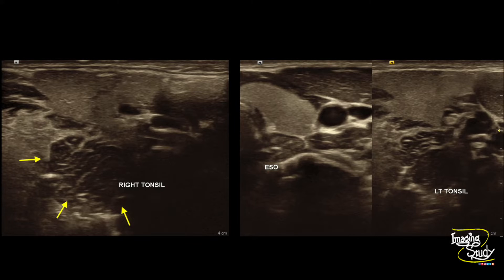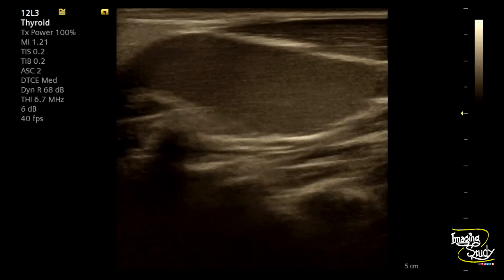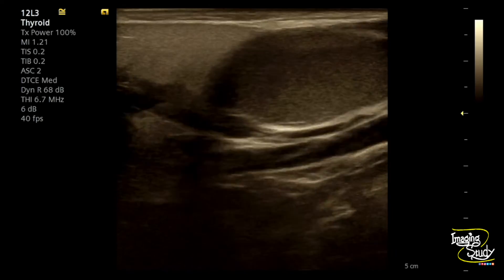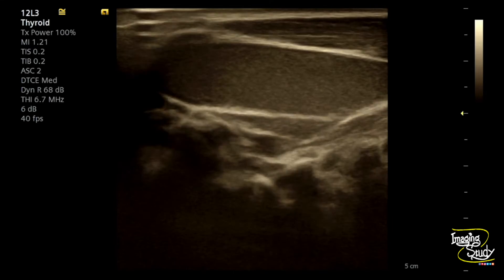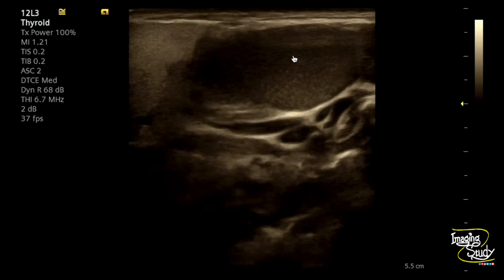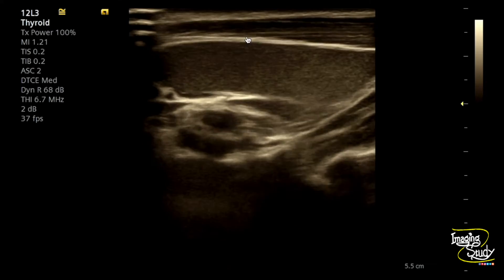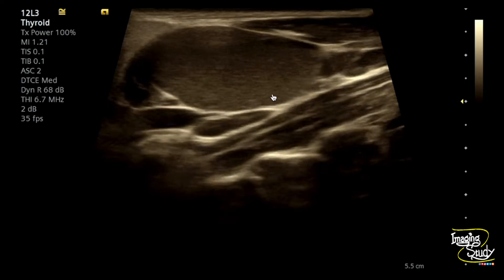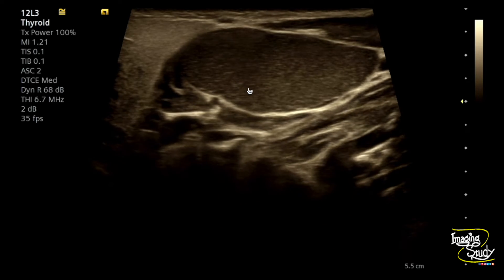Now let's look at the lesion we want to see today. Here is the section of the left submandibular region. You can see a cystic lesion here just adjacent to the submandibular gland. This is a thin-walled unilocular cystic area. You can see the internal content — it's hypoechoic, nothing but some debris.